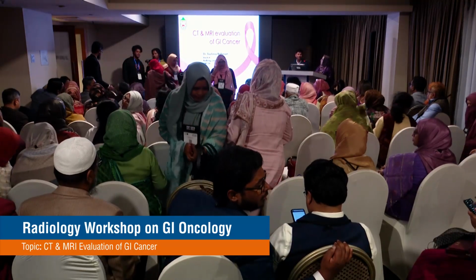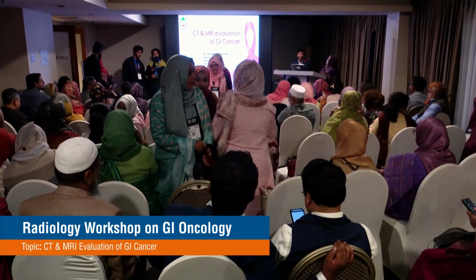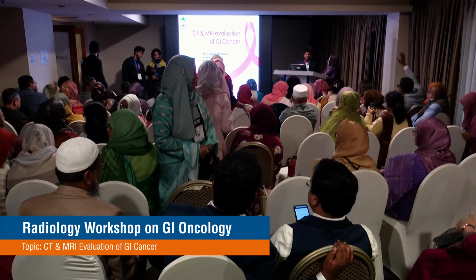Hello. Today my topic is CT and MRI evaluation of GI cancer.